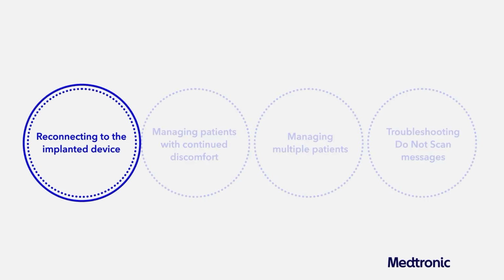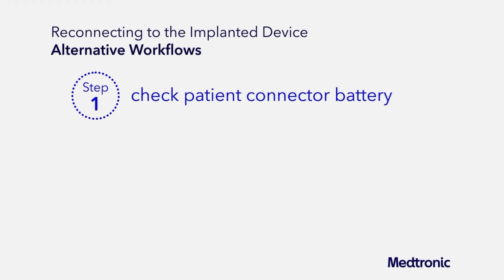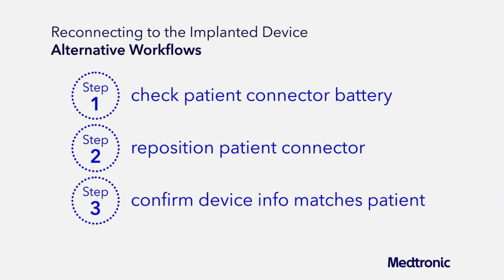Reconnecting to the implanted device. If you have difficulty reconnecting to the implanted device, try the following troubleshooting steps. First, make sure the patient connector battery is at least 20% charged or plugged into a charger. Next, reposition the patient connector over the implanted device. Last, confirm the patient's name and implanted device serial number match the information on the tablet.